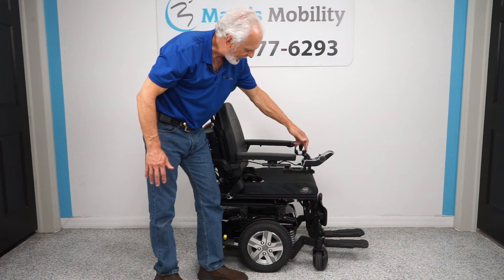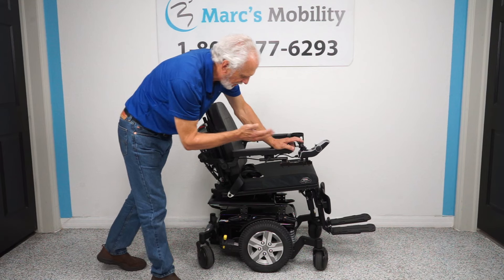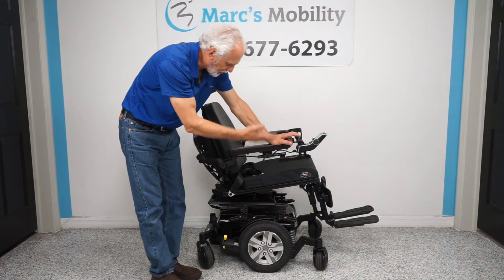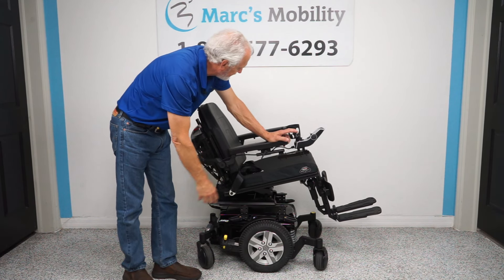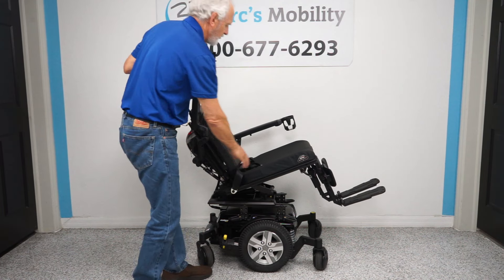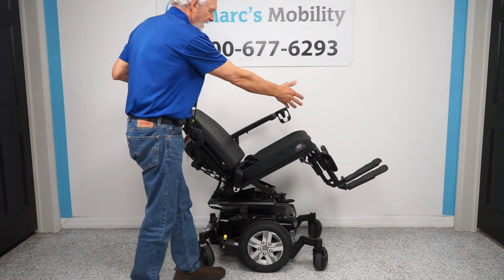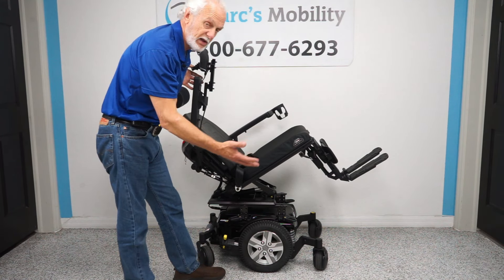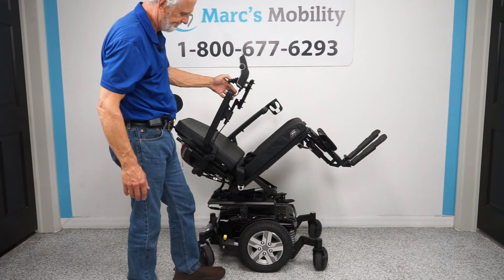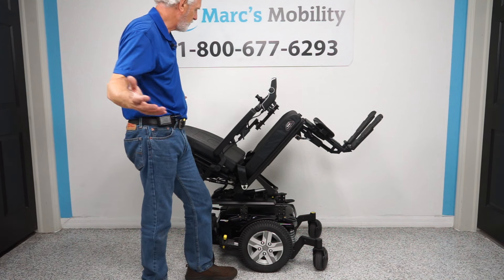With the bottom and back both yellow, I can move the joystick backward — you can see it going back. This is electric tilt. The legs and back go back together because they're all connected. This has great benefits if you need to relieve pressure off your bottom or back. That's as far as the tilt will go.